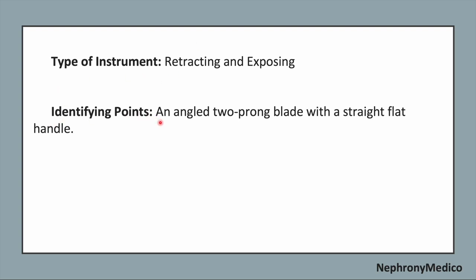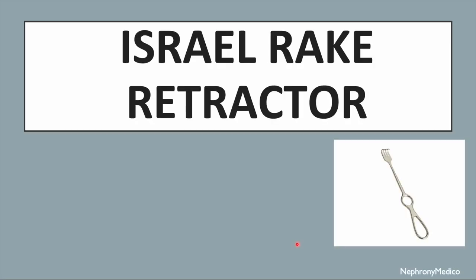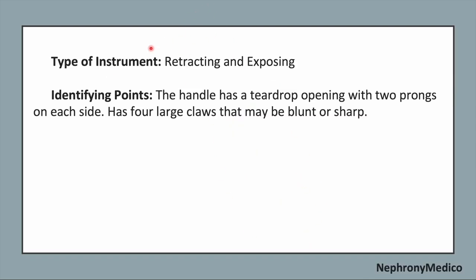Identifying points. An angled two-pronged blade with a straight flat handle. Use. It is placed between the glenoid and the humeral head to obtain exposure. Let's talk about Israel Rake Retractor. This is a picture showing Israel Rake Retractor. It is a retracting and exposing type of instrument.